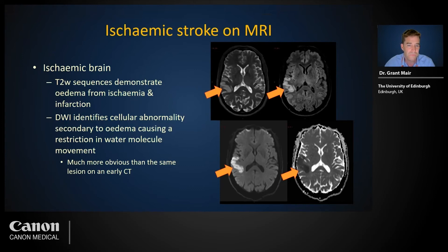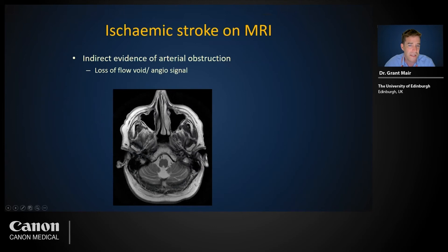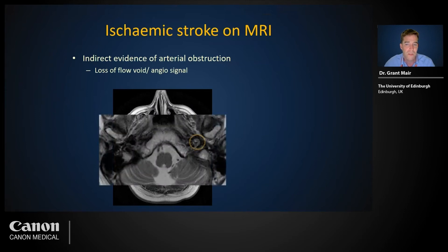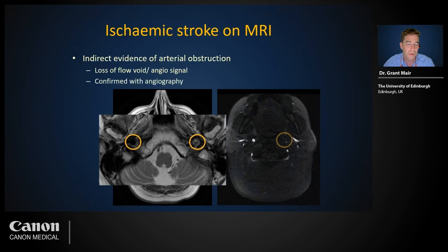Much like the dense artery sign on CT, MRI can also provide indirect evidence of arterial obstruction through loss of normal arterial flow voids. Moving blood does not normally return signal and appears black, whereas stationary blood clot does return signal and looks more like other tissues. Note the lack of the left internal carotid artery flow void on this image — this obstruction was then confirmed with MR angiography.